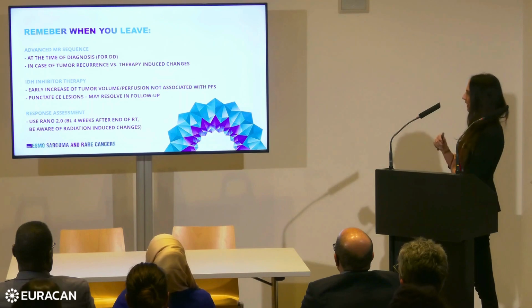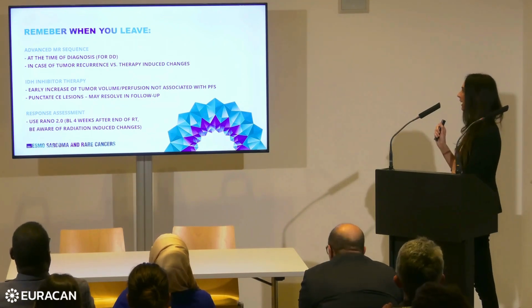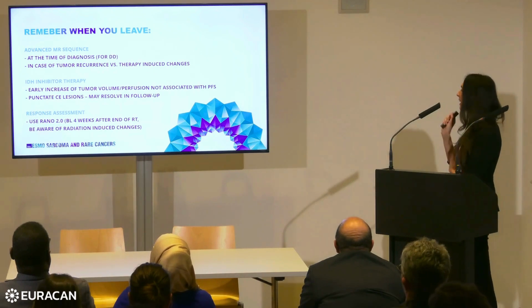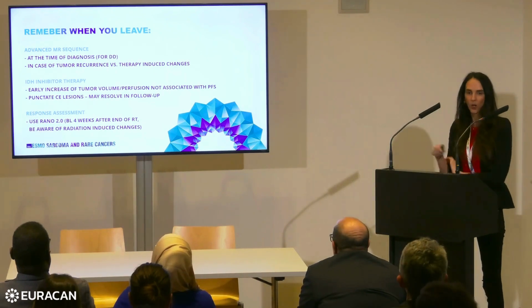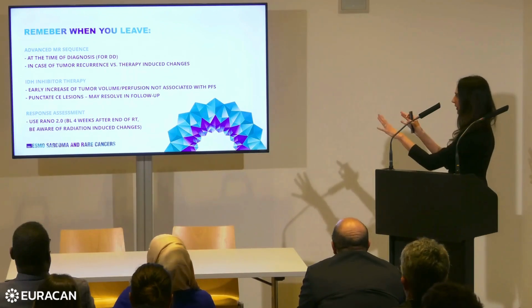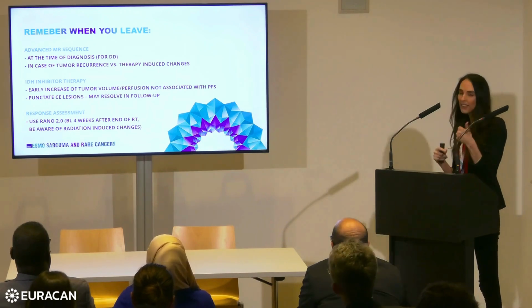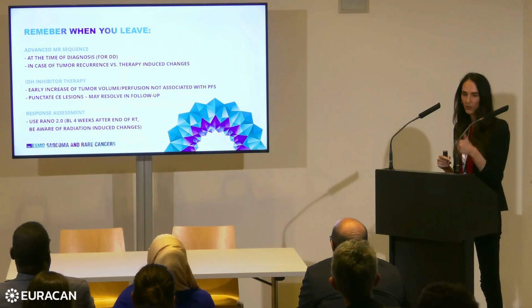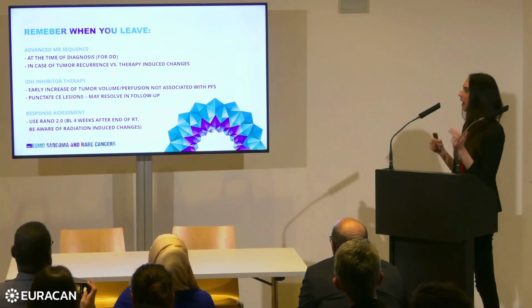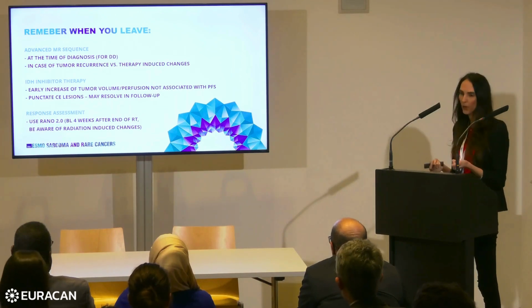So this is my last slide. When you go out of this room today and have dinner with your friends or drink a glass of wine, and someone asks you, what can you remember of this session? Please remember at least some of this. We use advanced MR sequences at least at the time of diagnosis to find the right diagnosis or exclude other differential diagnoses. And we use them when we are not sure, is this tumor recurrence or are these therapy-associated changes.